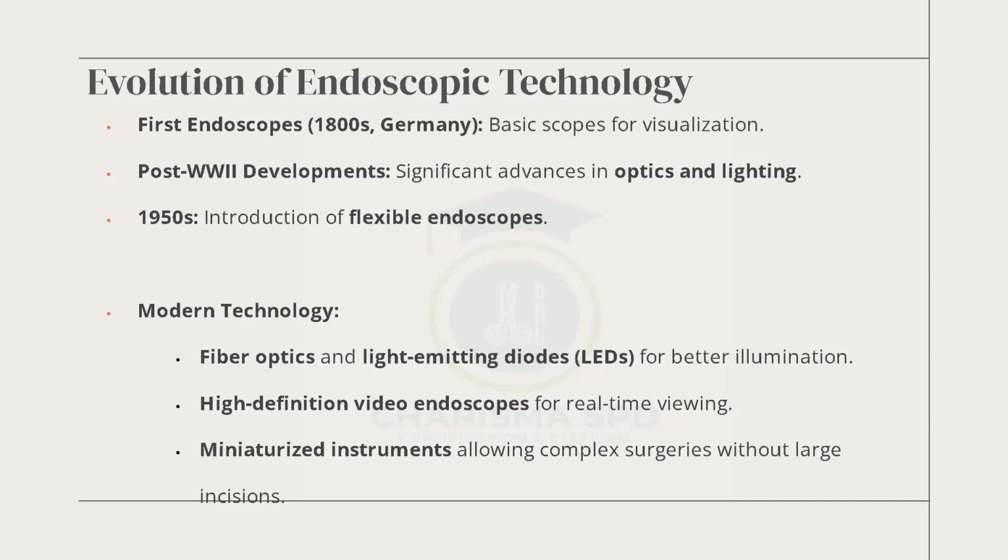human being's internal organs. It's very interesting to walk into the operating room and see somebody on the bed so helpless, and then they are working on him or her. And then we are able to entertain our eyes by watching the monitor with these video scopes doing a wonderful job. So high definition video scopes for real time viewing.